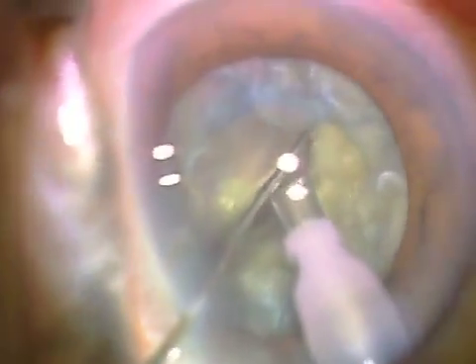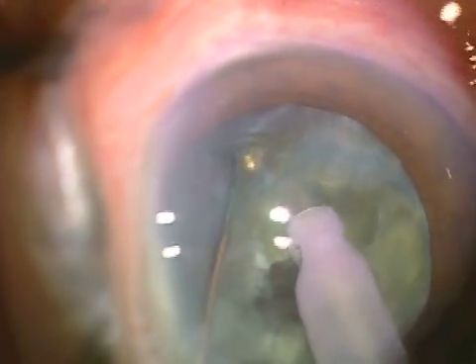It's not unusual, as you see here, for subsequent fractures to not want to be complete through the epinucleus. So it's important to stay deep in the nucleus with the tip as further tissue is engaged, so that one can achieve that complete fracture if at all possible. The second instrument can be used to further separate the apex if it's not fracturing easily because of the consistency of the lens.